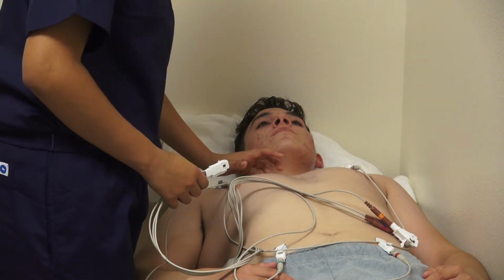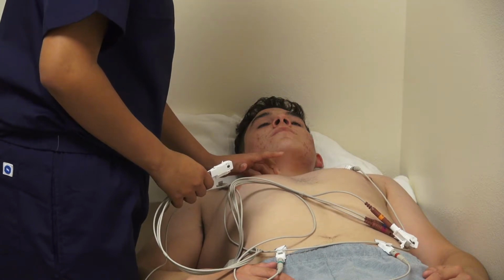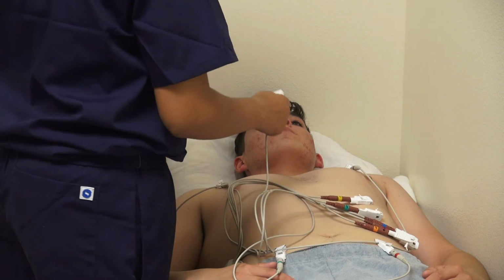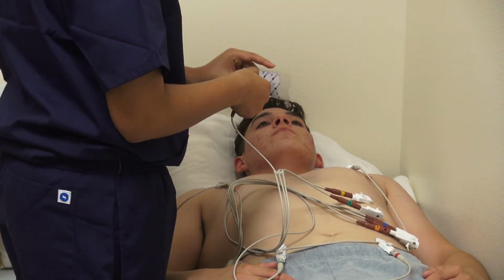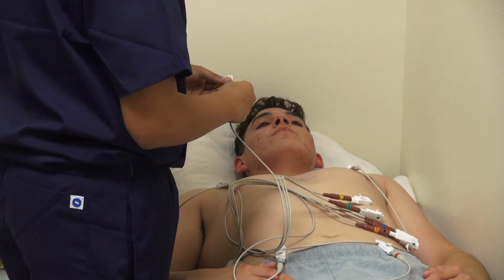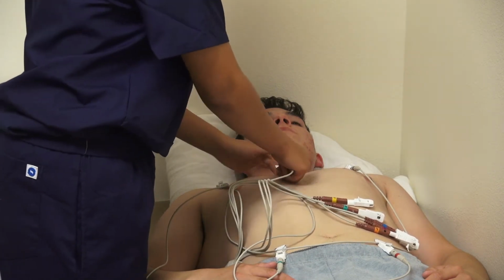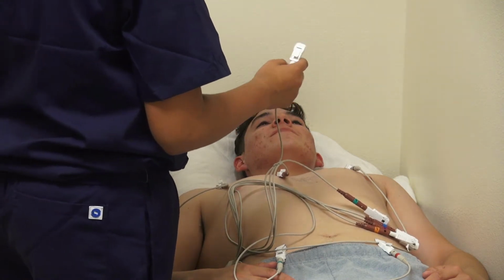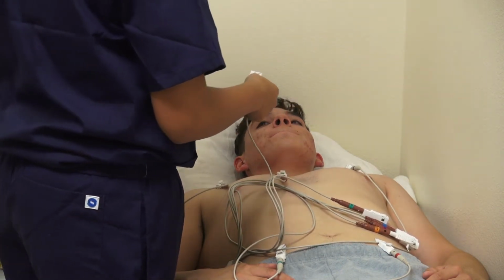First, locate the patient's 4th intercostal space right of the sternum for V1. V2 will be placed on the left side of the sternum in the fourth intercostal space as well.